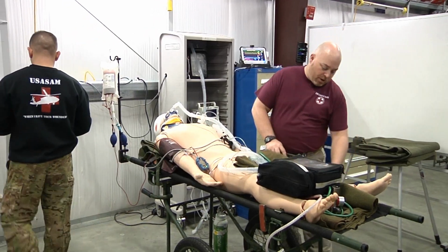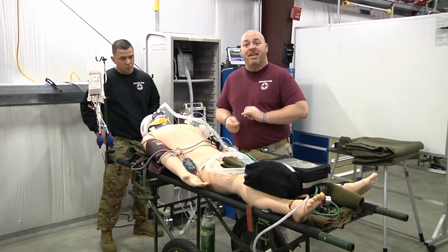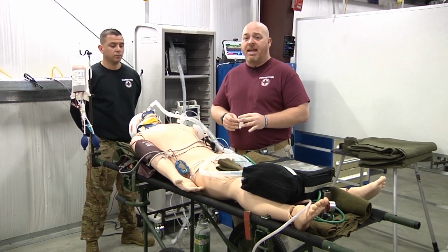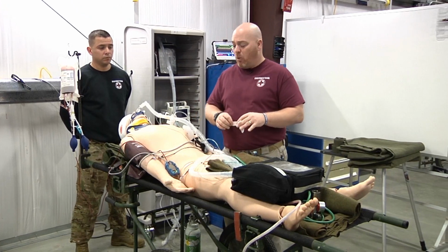Also, what you can do is you can mark your lines. It's important to note what your plan is in flight. So we may have to give medications. If I have IV bags hanging, maybe drips or whatever, I can annotate what's on each line at each port.